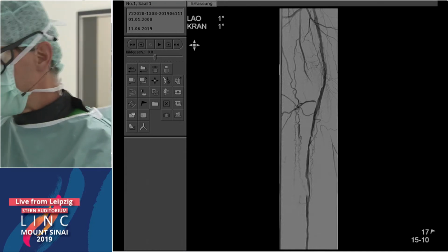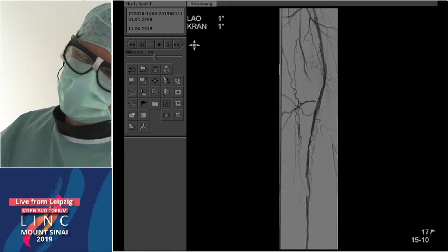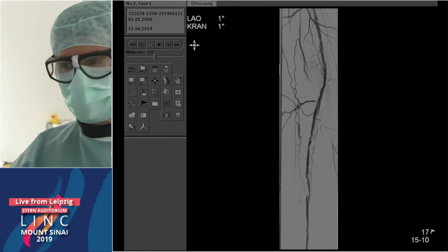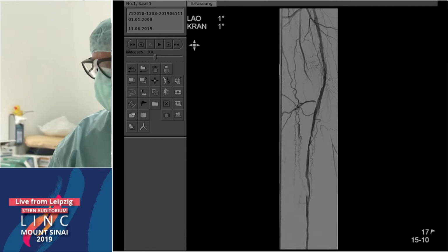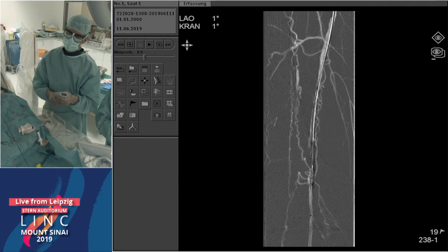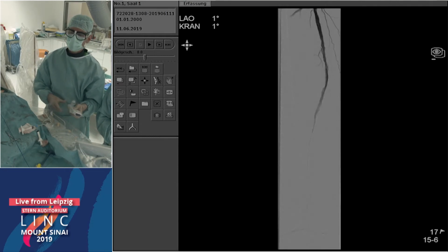Okay, so we'll take some more time to work on that lesion. Andre, maybe we just go on here with a couple of talks, and then we come back and see where you are, okay? Andre, you are live? Yes, Giancarlo, can you hear us?